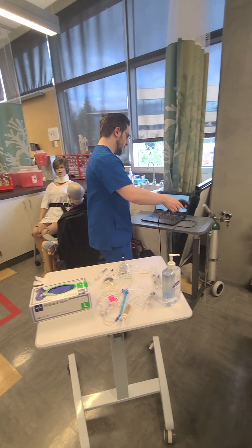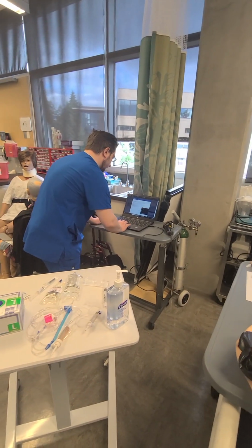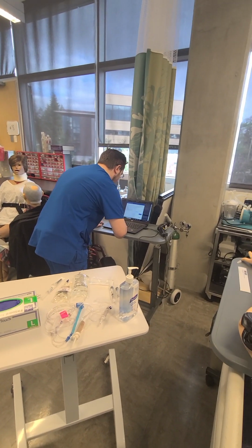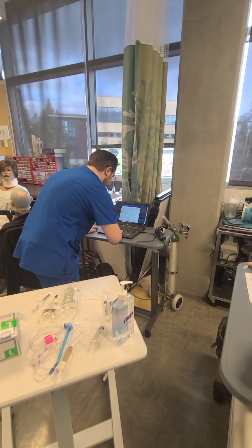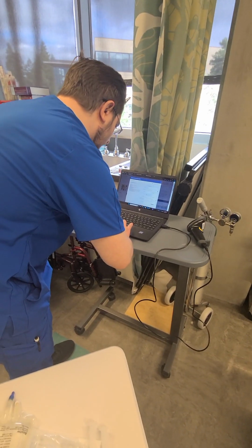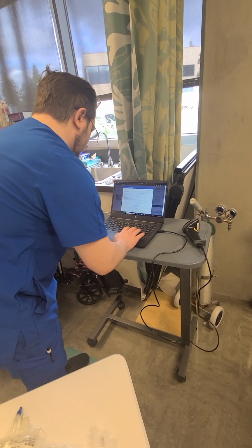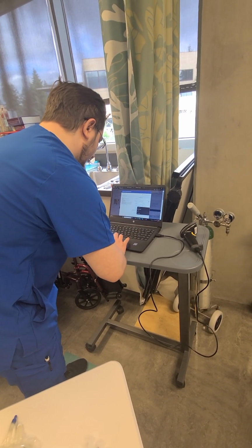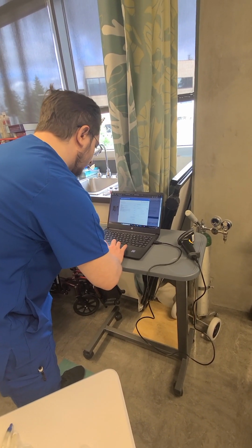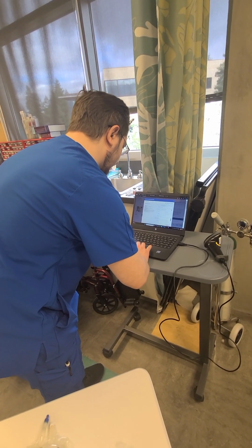And the Zofran works. And then it's going to ask me everything about it, so I'll just write down what I have. So 4 milligrams of Zofran, rate 2 milliliters over 2 minutes, 1 milliliter a minute.